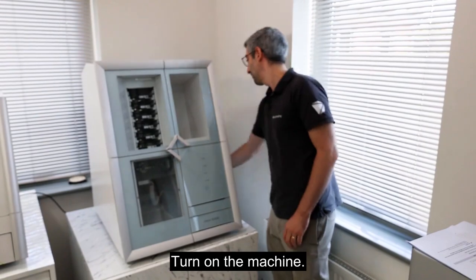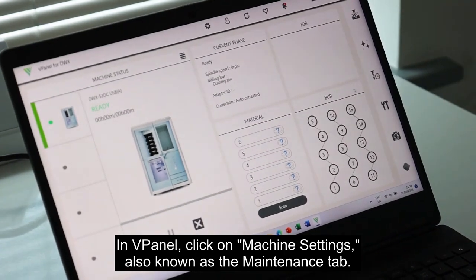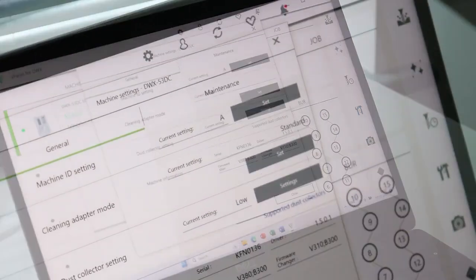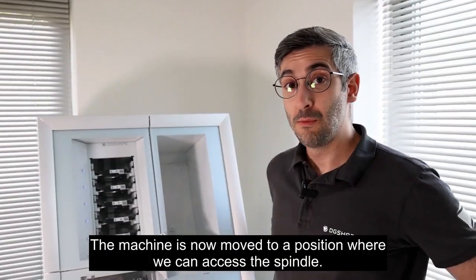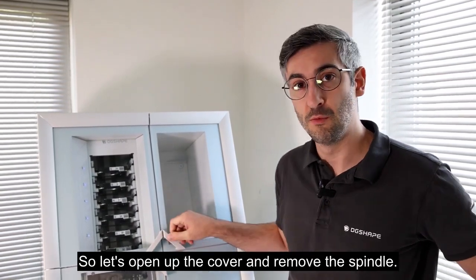Turn on the machine. In vPanel, click on Machine Settings, also known as the Maintenance tab. Then click on Maintenance, then Spindle Replacement. The machine is now moved to a position where we can access the spindle, so let's open up the cover and remove the spindle.